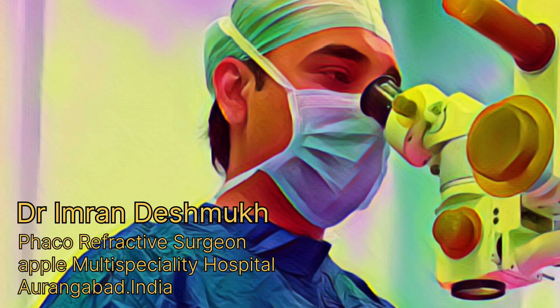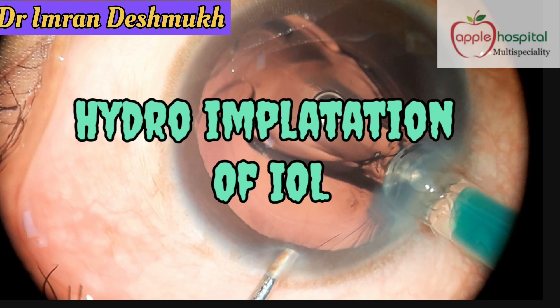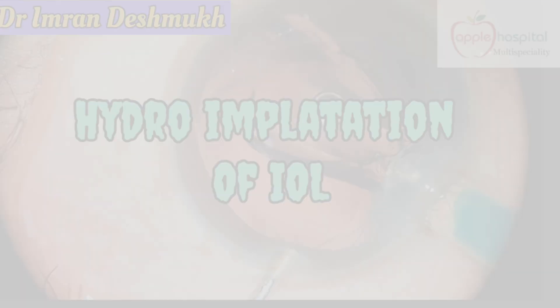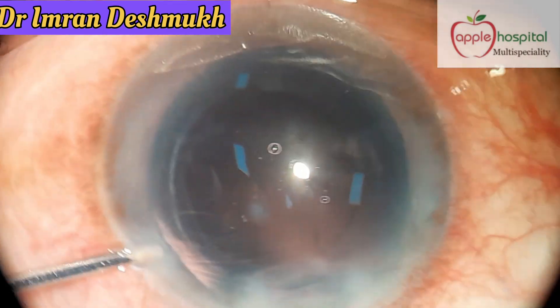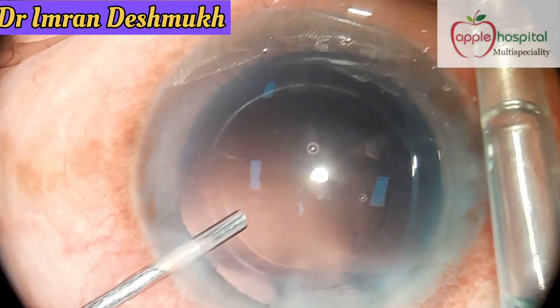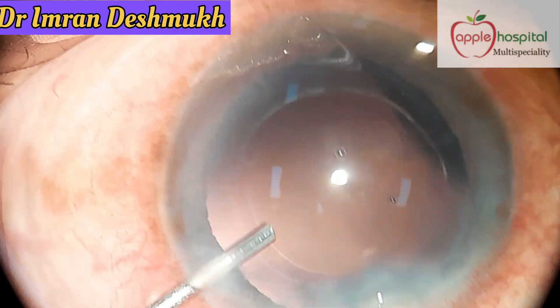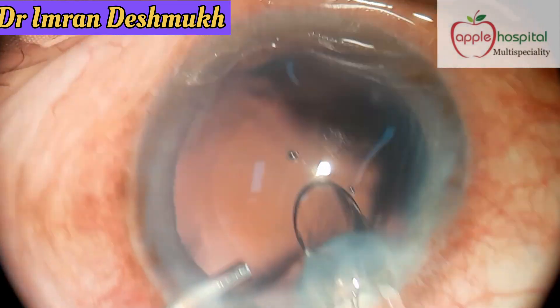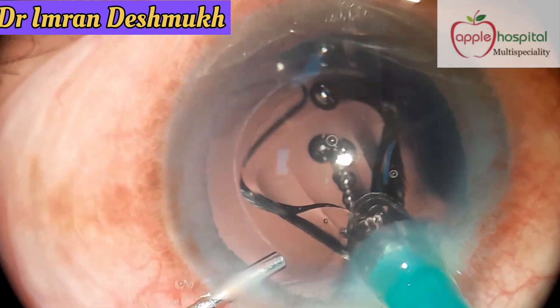Hello everyone, this is Dr. Imran Deshmukh from India. Today we'll be discussing how to perform hydro implantation of IOL after cataract surgery. I call this technique the lazy surgeon's technique because it definitely reduces the surgical time — the time required to remove the excess visco in the anterior chamber and the visco behind the IOL.